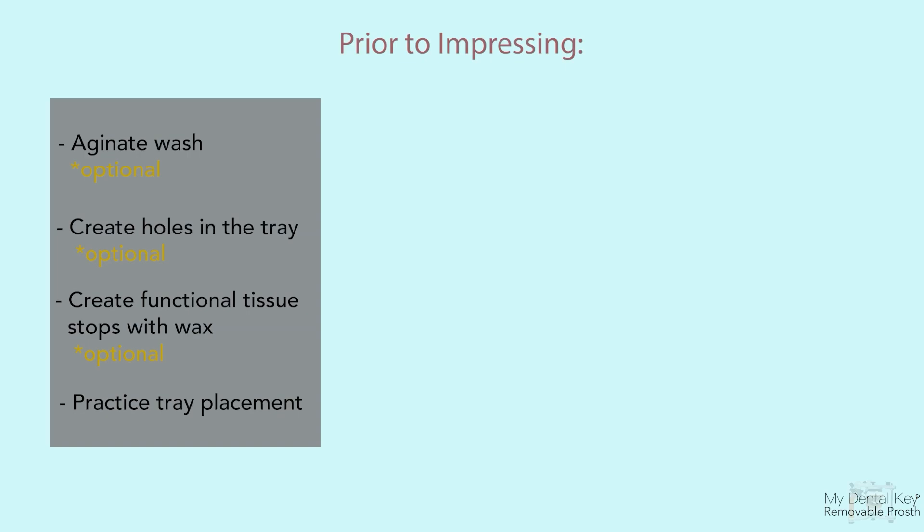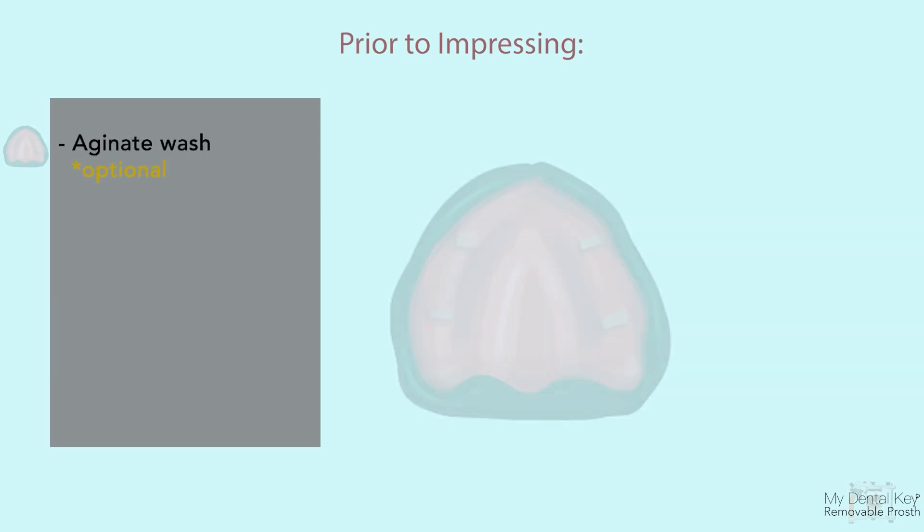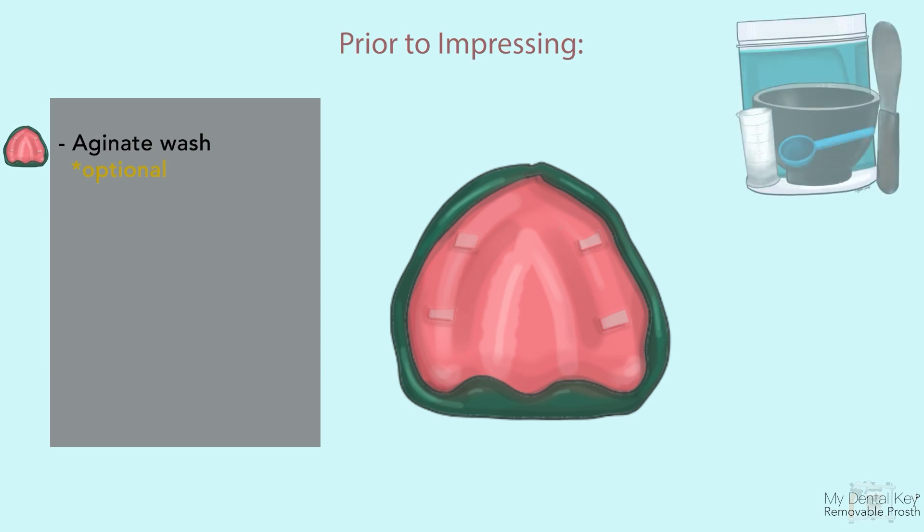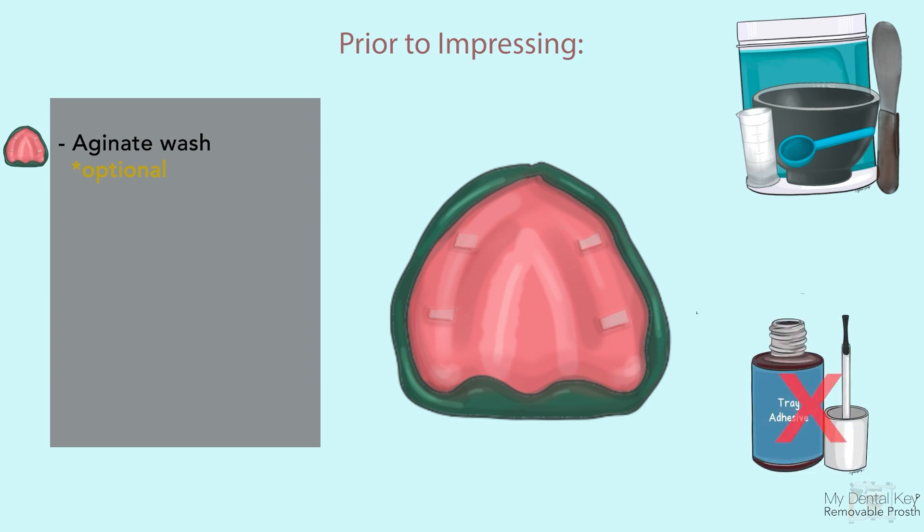Start by reviewing some helpful tips that will improve the outcome of your final impression. After border molding is completed, you can check that your border molding is accurate and not overextended. To do so, perform an alginate wash — a check step before proceeding to your final impression.